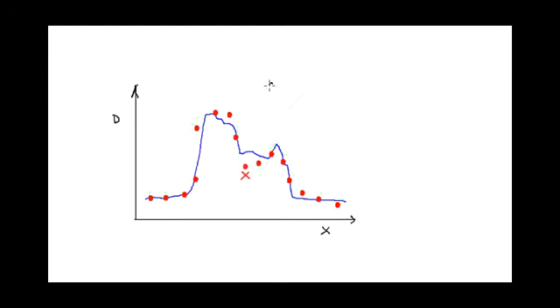field. So this is called gamma analysis, and the gamma is some combination of distance and dose, as I showed you. And this circle here is defined as gamma equals 1, and we can change the size of that circle.